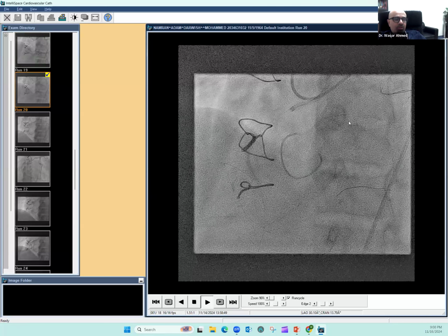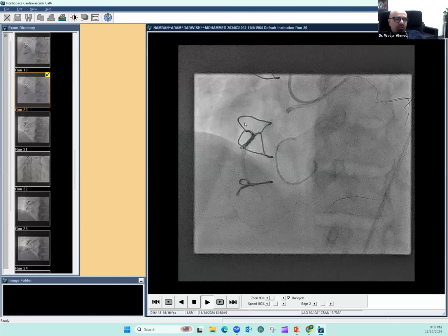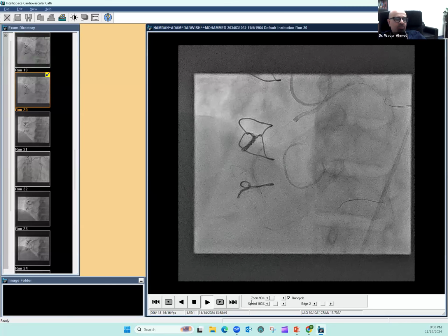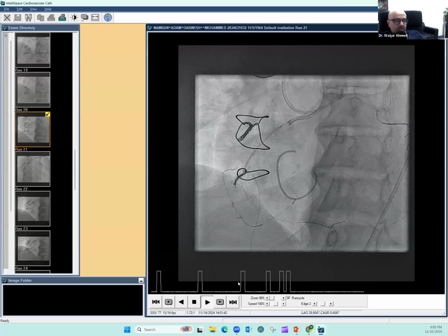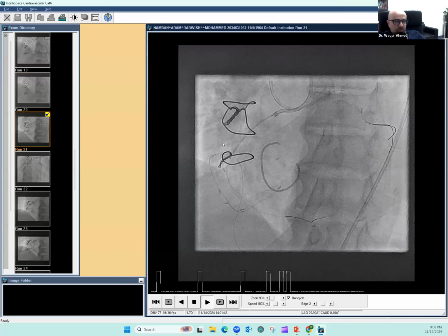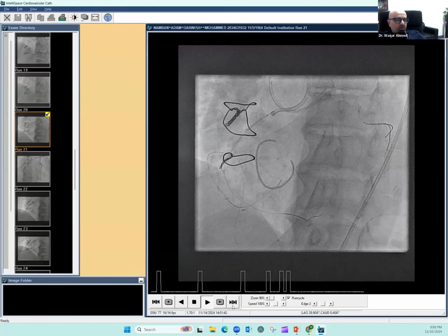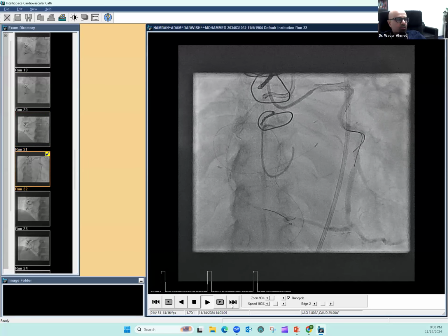I had flipped because I did not want to leave the externalized wire in the epicardial collateral. So once I had the microcatheter down, we switched back to just an antegrade workhorse wire. So that was the 38 millimeter Nagomi stent, followed with a 3.0 by 32 millimeter Nagomi stent overlapped. So 38 plus 32 is about 70 millimeters of stents here.